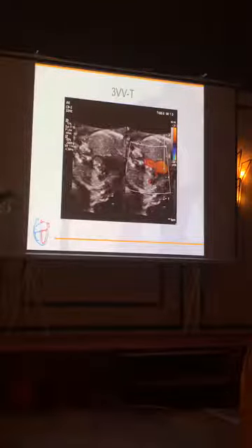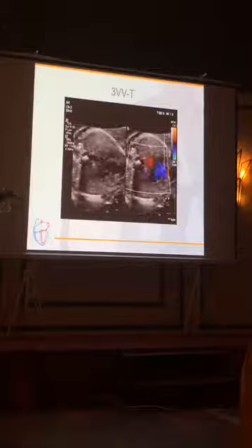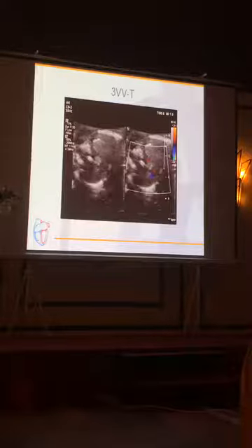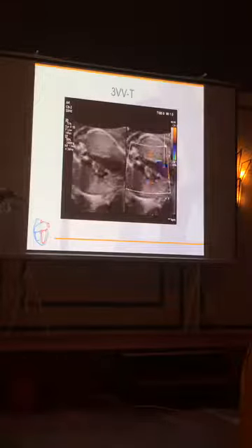Aortic coarctation or interrupted. Yes, so it could be a coarctation with a very thin arch, because sometimes it's difficult to see, and it could be interrupted. Sometimes it's quite difficult to differentiate if it is really interrupted or it's just very tiny and you can't see it.